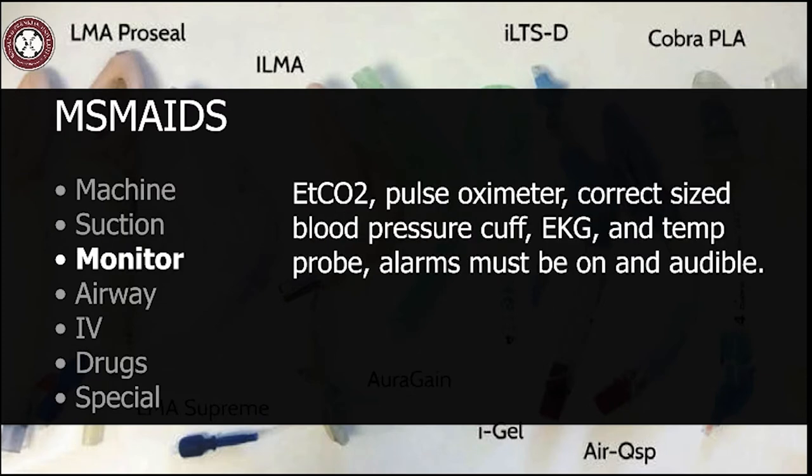Monitor refers to all standard monitoring equipment, including the pulse oximeter, a properly sized blood pressure cuff, EKG, end-tidal CO2, and temp probe. Everything must be set up and ready for use. Alarms must be on, audible, and properly set for the patient, for instance, peds versus adults.